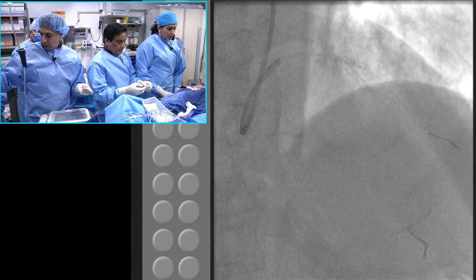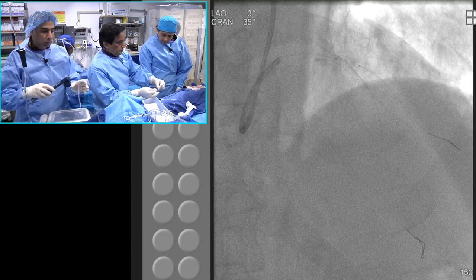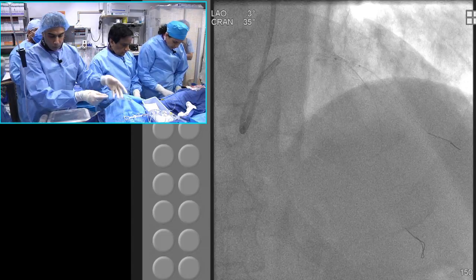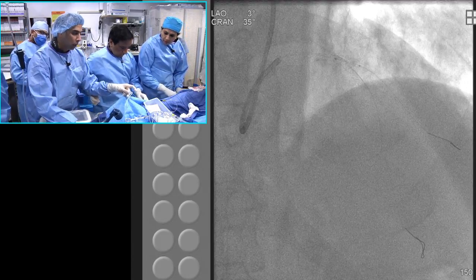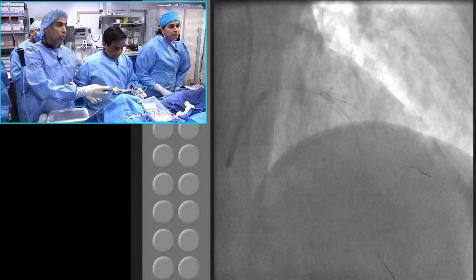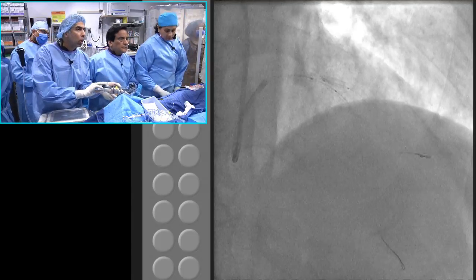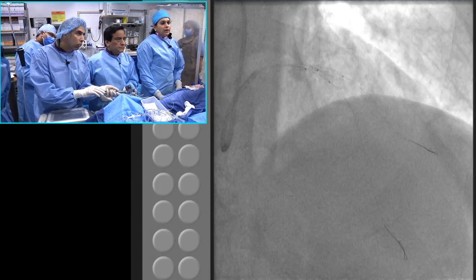Keep this on the back, keep it like that. Do we have the groin prepped or no? Another important thing: even if you're doing radial, for whatever reason, you need to have a groin prep for any emergency. You need immediate balloon pump access. STs are way better. Any simple lesion can become sour. So you're planning to do the final kissing? Yes, right now. We have a 3.5 high pressure balloon in the LAD, a 2.5 in the diagonal.